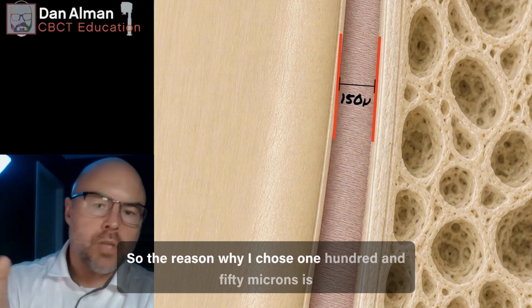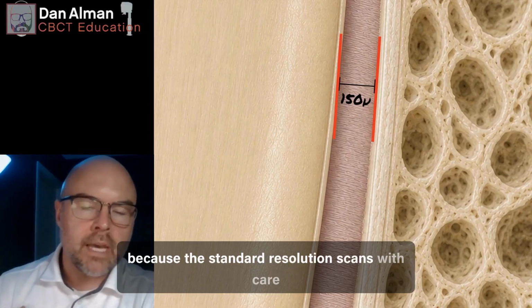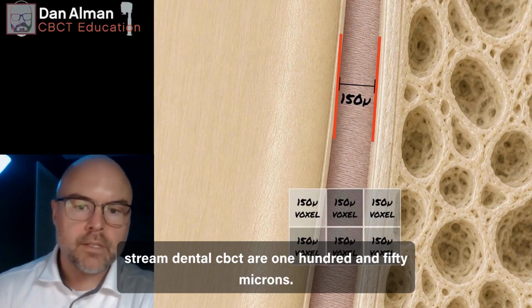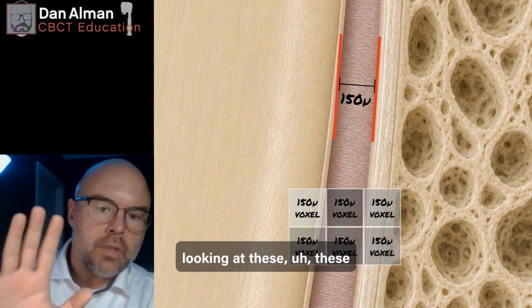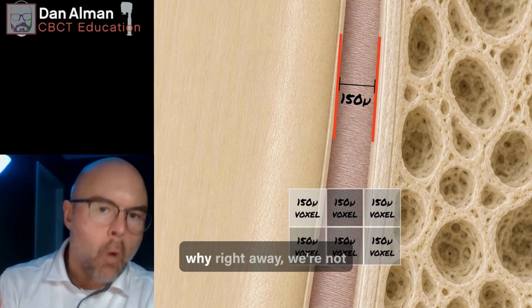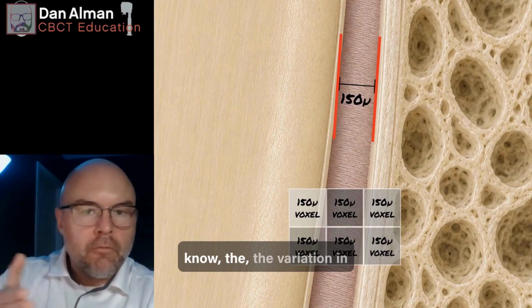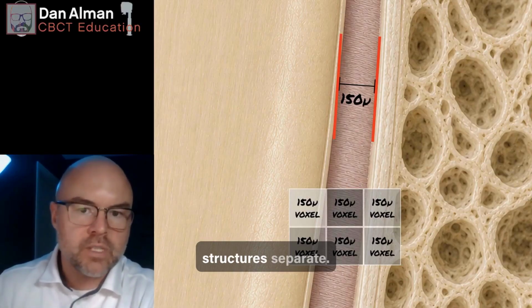So the reason why I chose 150 microns is because the standard resolution scans with Carestream Dental CBCTs are 150 microns. All right. And we can tell, just as we're looking at these 150 micron voxels inside of that space, why right away we're not going to be able to see the variation in those shades of gray, to be able to see how those structures separate.